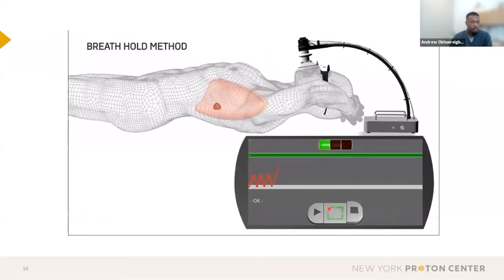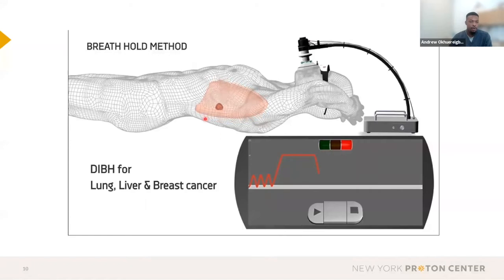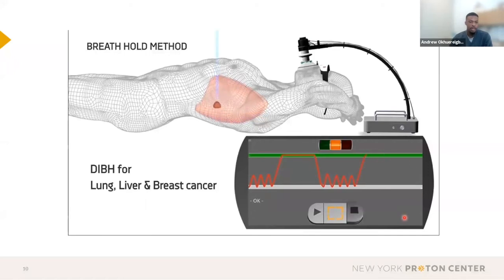After 3 consecutive normal breaths, we signify that the patient is going to that green bar. At that point is when we deliver the radiation beam. As you can see, while the patient is in that green bar breath hold, the tumor is not moving. Once the patient continues breathing normally again, we wait another 3. Once they have another 3 normal breaths, we signify that they can go right back into that breath hold green bar, and that's when we deliver the radiation beam.